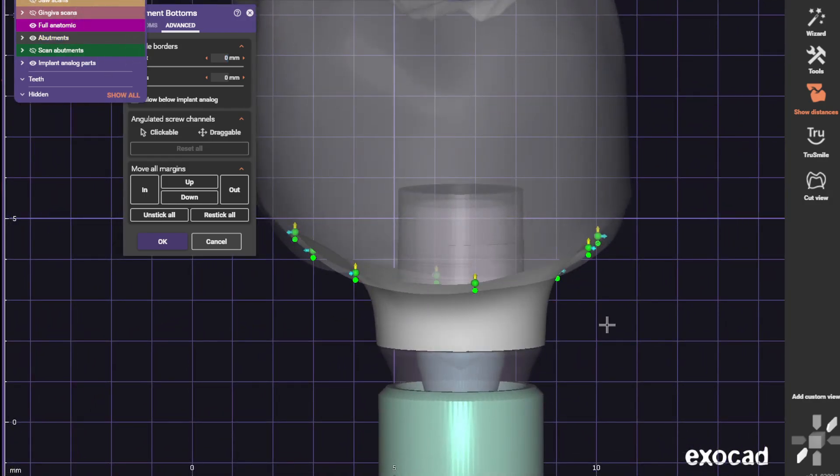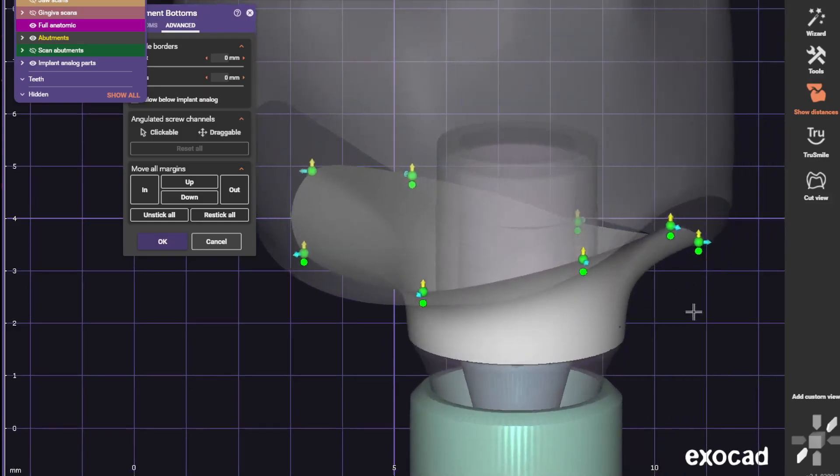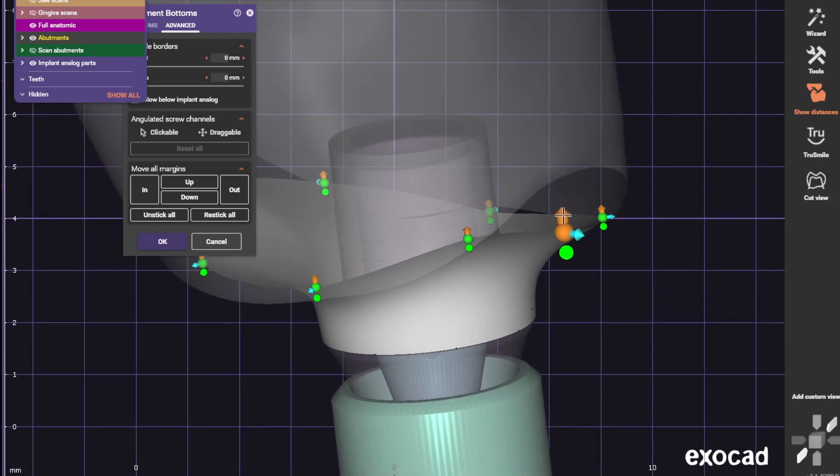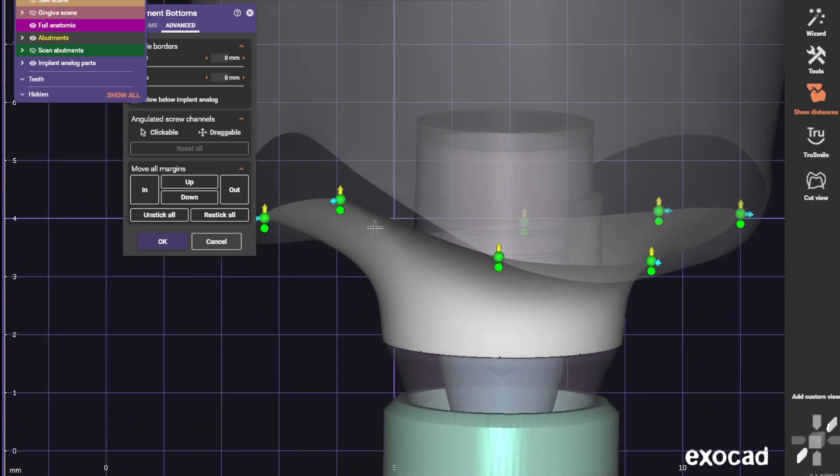Now we'll go ahead and adapt those. See this little area right here? That's a food trap, so just drop this down. Same with right here, it's another food trap. Drop this down.